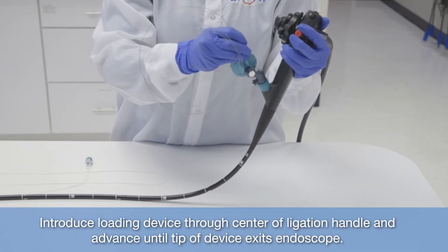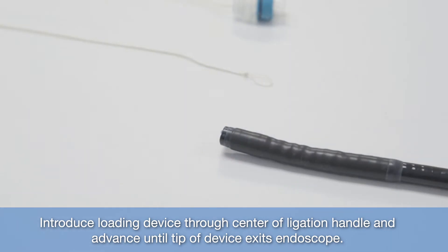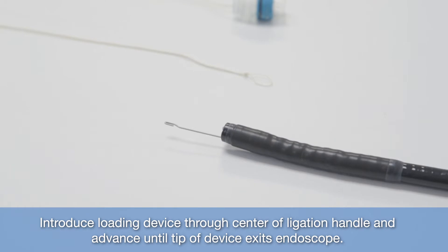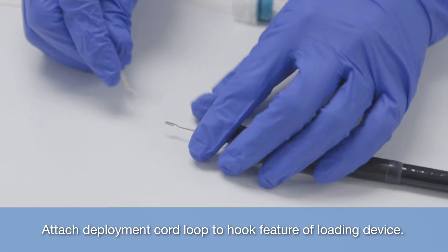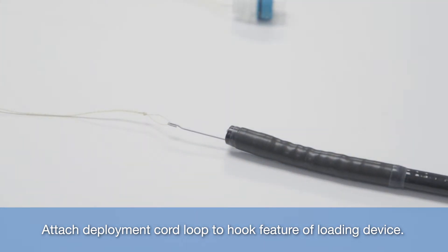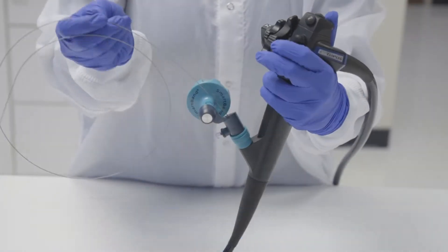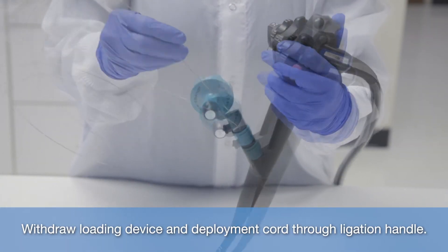Introduce loading device through center of ligation handle and advance until tip of device exits endoscope. Attach deployment cord loop to hook feature of loading device. Withdraw loading device and deployment cord through ligation handle.